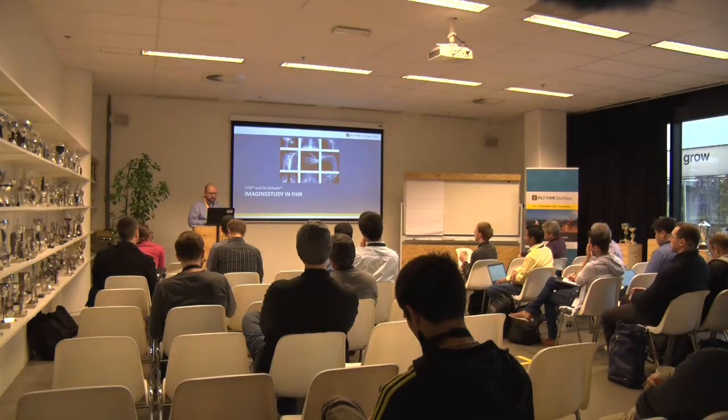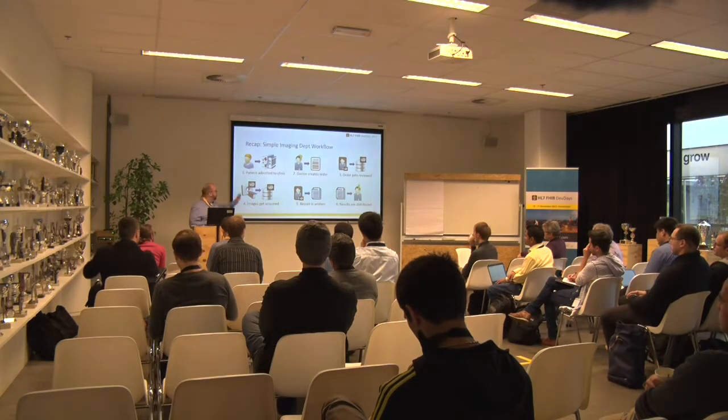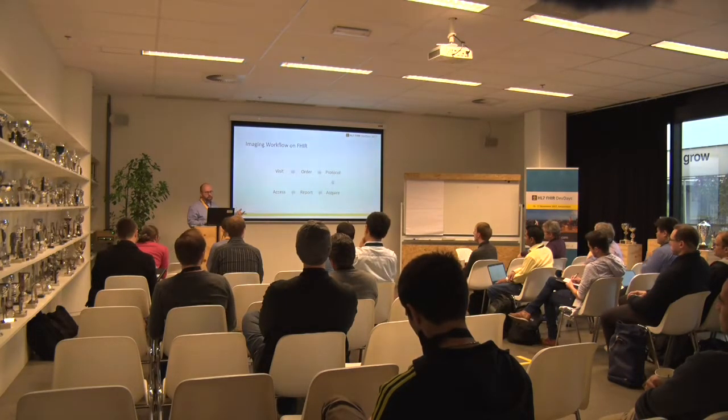So looking at imaging study in FHIR. Here's the time check. I don't want to go too long here. So recap, right? We went through that workflow. If we were to map that onto FHIR objects, we'd look at the visit, order, protocol, acquire, report, and access. Those are our use case steps.